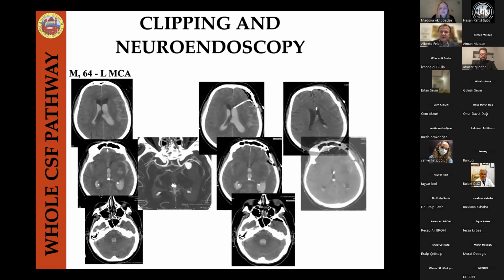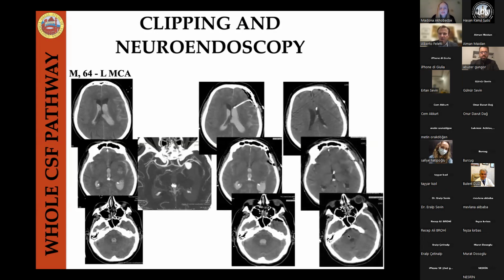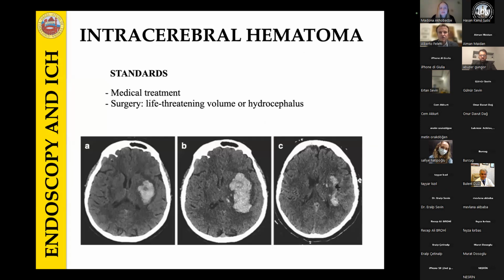So immediately after clipping, I did endoscopy, and this is the immediate result of this patient. I want to mention also the possibility to use endoscopy for intracerebral pathologies like an intracerebral hematoma. The standard of treatment in this case is medical treatment, unless there is a life-threatening hemorrhage.